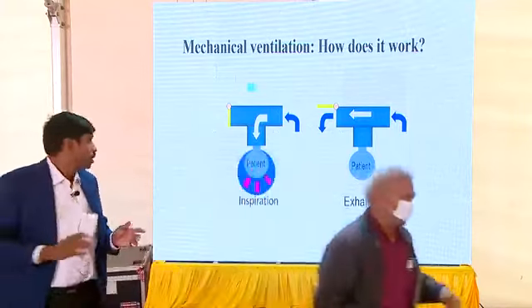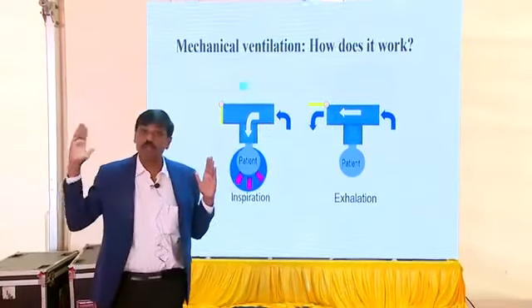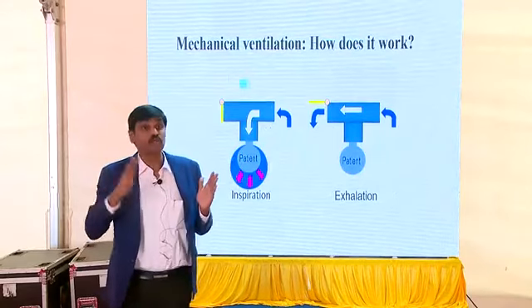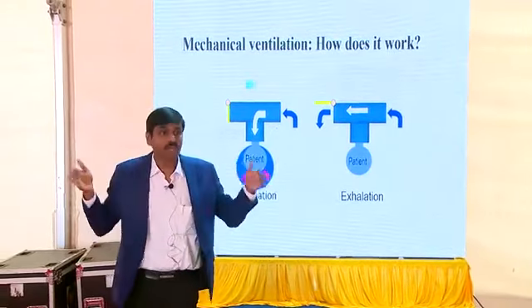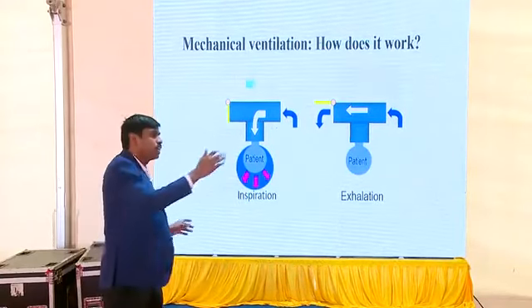Yeah okay, so it's quite simple. Ventilator is quite simple. So the expiratory valve controls how long the expiration is going to be, and depending on how much it's open or closed, you can also control the gas flow. So that's a simplified part of ventilation.